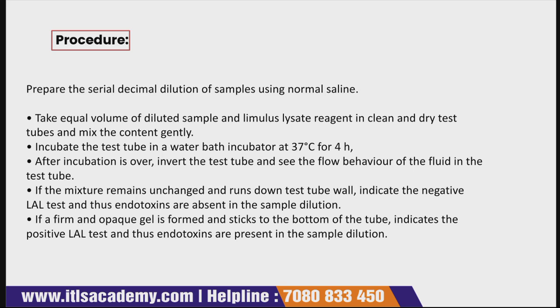Then you have to incubate the test tube in the water bath. And what should be the incubator temperature? 37 degrees centigrade, for 4 hours. So you incubate the test tube in the water bath incubator at a temperature of 37 degrees centigrade for 4 hours.